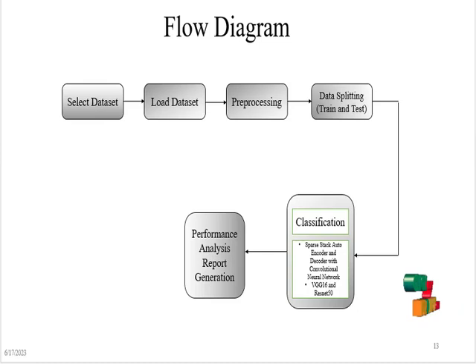Here we are going to see the reports as a graph between the validation and original input, and then we are going to check the accuracy of each algorithm. After that we are going to see the confusion matrix, that is true positive, true negative, false positive, false negative values of the data. At last we are going to predict by selecting an input image, and detect whether it is affected by cancer or not.